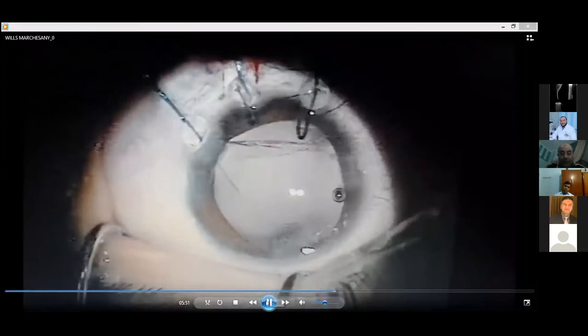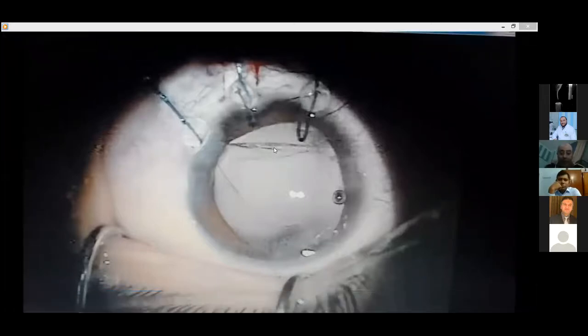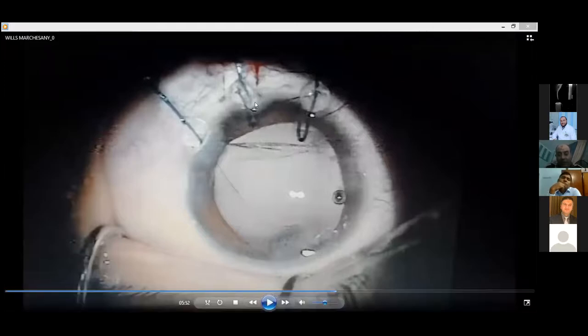This is the situation I faced. Anterior rexis, equator. This is the anterior vitreous face. And I have no angle or shelf of the anterior capsule to insert the capsular tension ring. So what can I do? If I insert a capsular tension ring, even with one point scleral fixation, it will be adhered to the pars plana, not extending the capsule, and there is always a gap which may allow the intraocular lens to drop down into the vitreous. So I have a plan B.